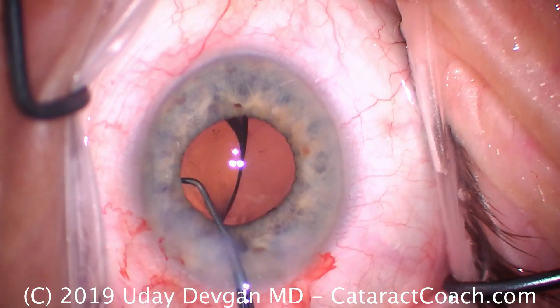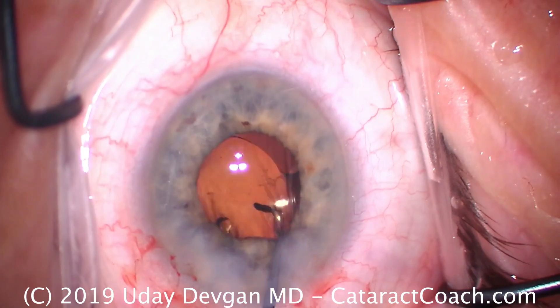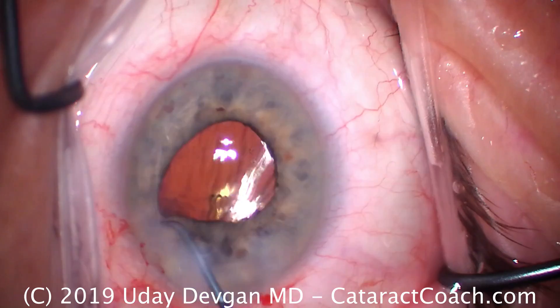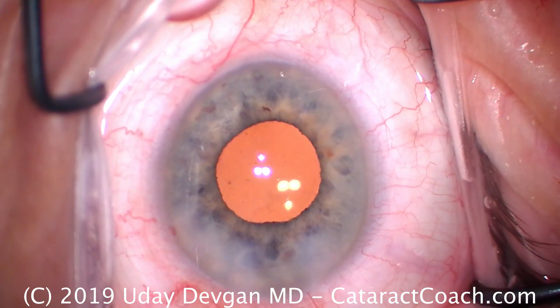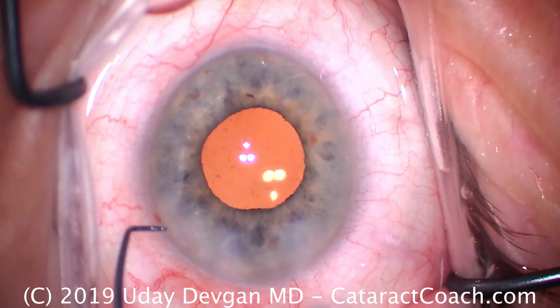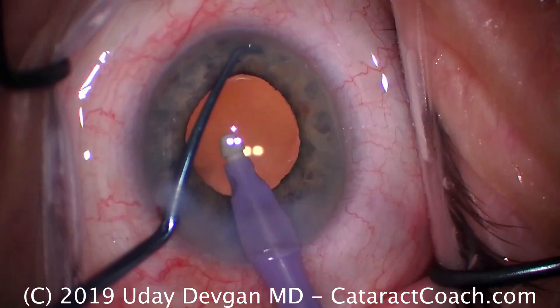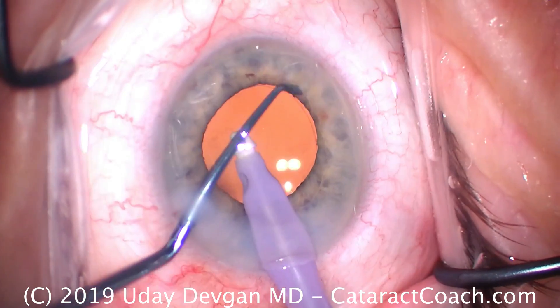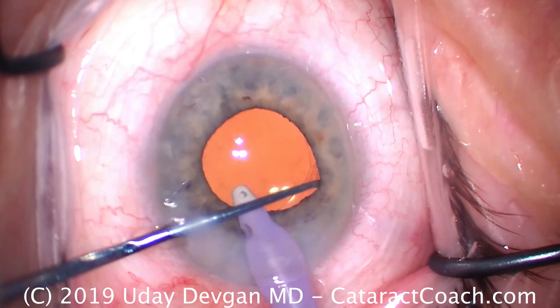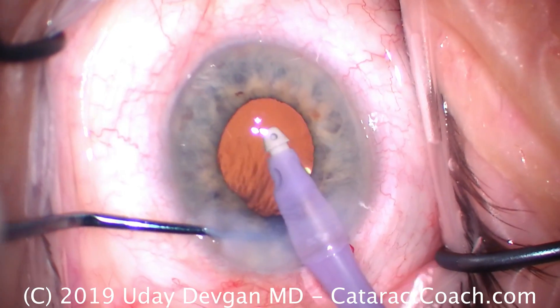So now I'll ask for a new chopper. But now the question is — remember, you're doing the surgery — you now realize the chopper tip is broken. Is there a piece of the chopper left in the eye? I mean, I don't see it, but how do we know? Here's the new chopper — look at the difference in the tip, much different. Let's check all the quadrants. I don't think I saw any piece of the chopper tip there, but certainly that other chopper had a broken tip.